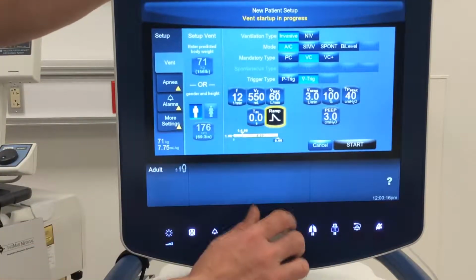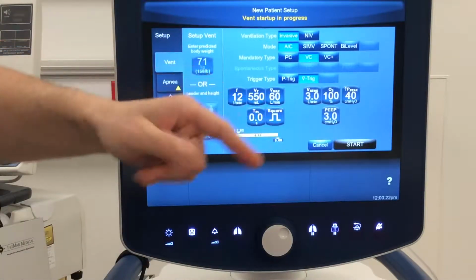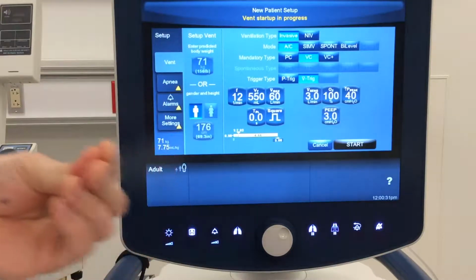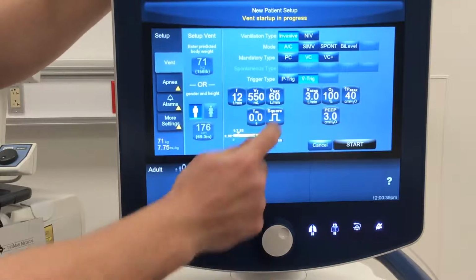Okay, why is this important? Well, there's other options. We can do a constant or a square. In this case, we're delivering 60 liters a minute at the beginning, all the way to 60 liters a minute at the end. So I know you can't see me right now, but think about that. If you were breathing at the same flow rate at the beginning of the breath as you were at the end, not very comfortable, okay? And consequently, this does play a role on our inspiratory time.